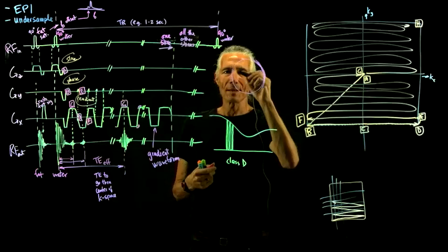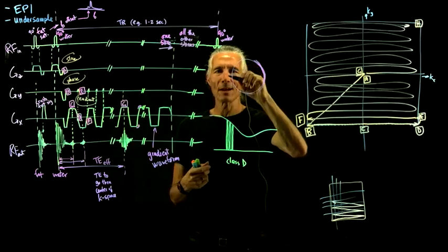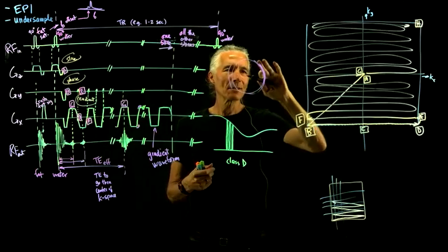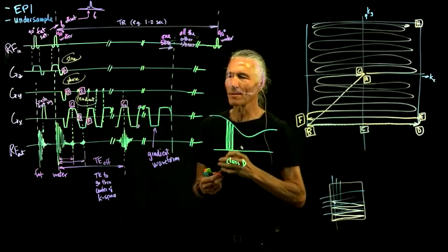And what will happen, like I said, on one side it'll be okay, like the fat will be sitting out in the air like that, but on the other side the fat is going to be moved inside the brain, like a little white stripe inside the brain, and then really mess it up.